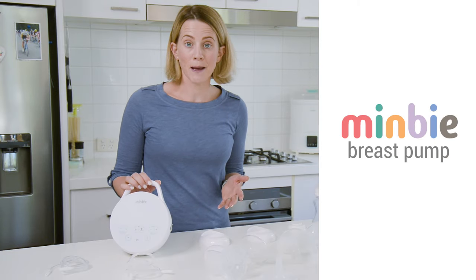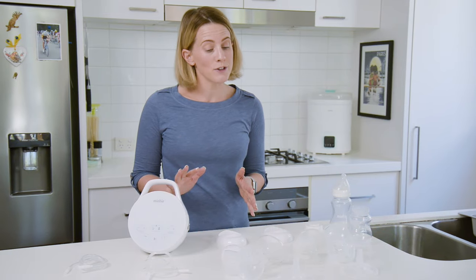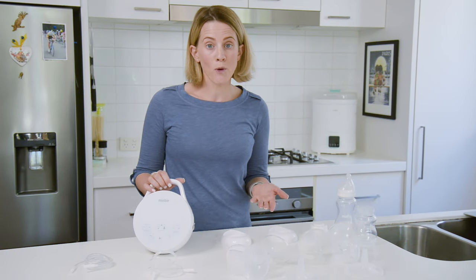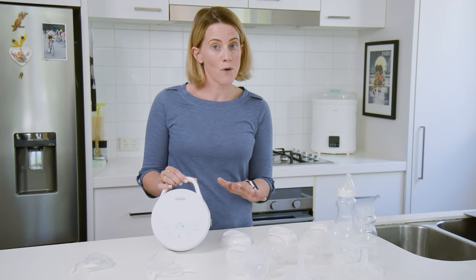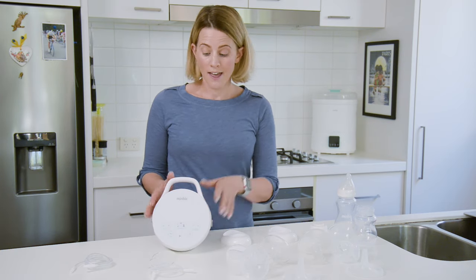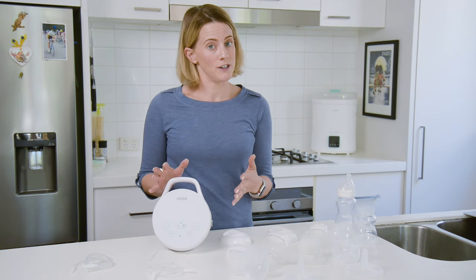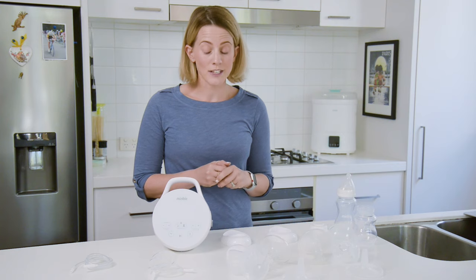This is the Minbie breast pump. The reason why I love this breast pump is it's really simple to use, which I'll show you later. It is portable, so it doesn't matter where you are in the house. Once you've charged it for four hours for a full charge, it has two hours of use in it. It's also really efficient — I found this more efficient than one of the competitor ones that I was using.